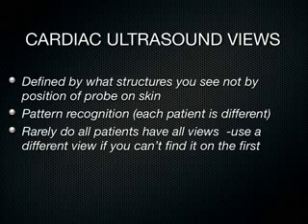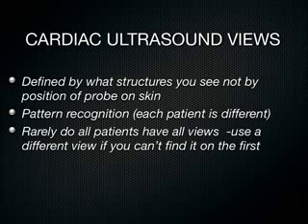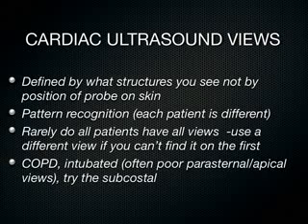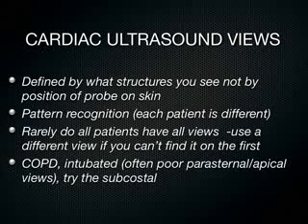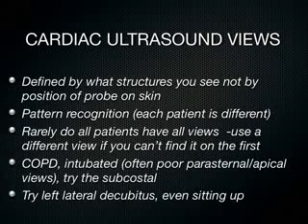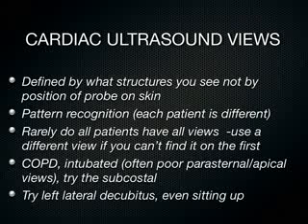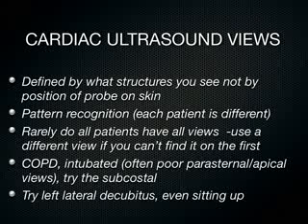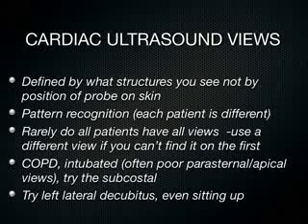Some people have really nice subxiphoid views. They've got a big liver, and I can see their heart really well subcostally, but they're a heavy smoker, and I go look parasternally or apically, and there's no heart because the lung expanded to take up my cardiac view on the chest. And so that's why patients who have COPD, who are intubated, often have very challenging parasternal or apical views. And you watch a cardiac sonographer do an ultrasound. They always roll the patient. They stick a pillow under the right scapula, roll the patient left lateral decubitus, which brings the PMI to the chest wall. You can always get better views if you roll the patient to their left. That's the big secret here.